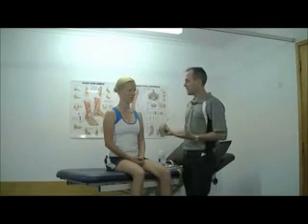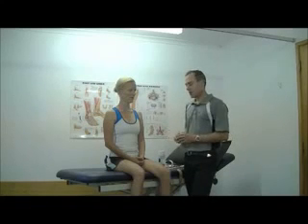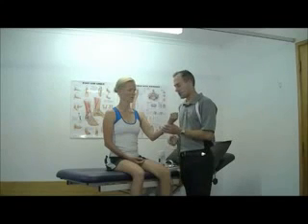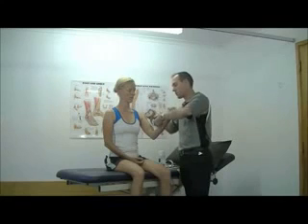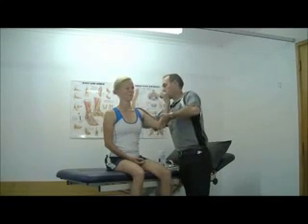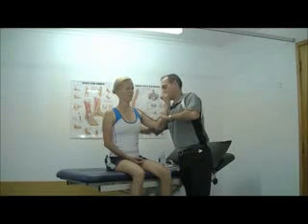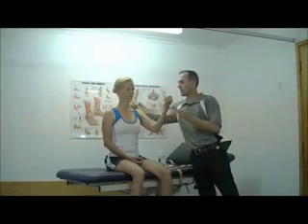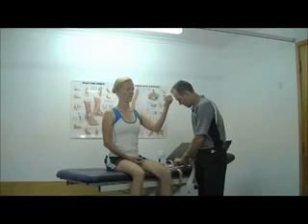As I mentioned, the idea with the dynamic tape is to assist the muscle action. So in its simplest form, we generally apply it in a shortened position with stretch on it. So for biceps, for example, very simply, we could actually just apply in this position, run it up, also bring the shoulder into some elevation, correct that scapular position at the same time, and run it down and onto the back. When you're measuring your tape, if you measure the length that you want and back it off by about a third, that's generally the right amount of tape to use.